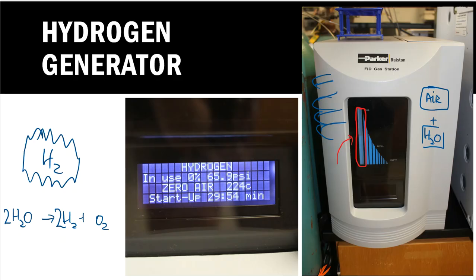But at some point in time, I probably would want to fill this up or drain out what's in there and fill it up with fresh deionized water. This is not tap water, and preferably it needs to be distilled and deionized, not just deionized, but we don't have an in-house distillery. So, in other words, we settle with deionized water, it's clean enough, we'll be fine, and that's what we'll use for this analysis.